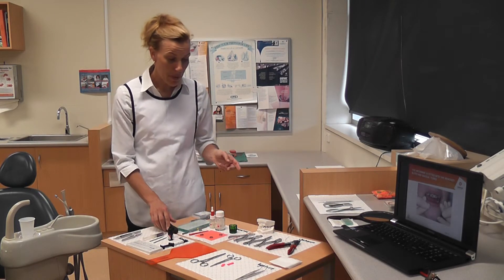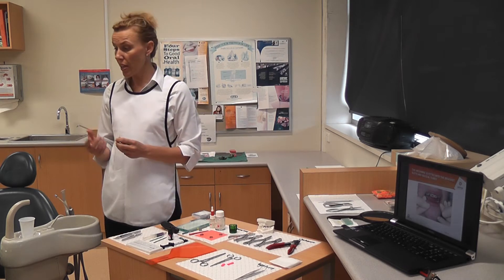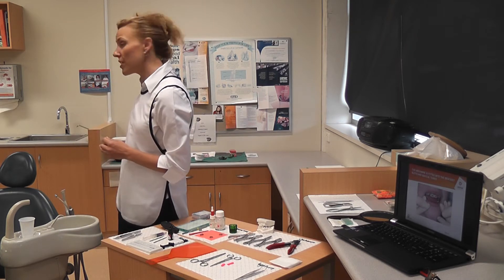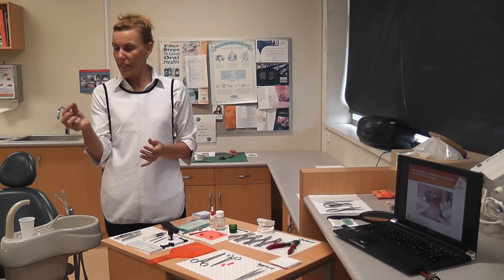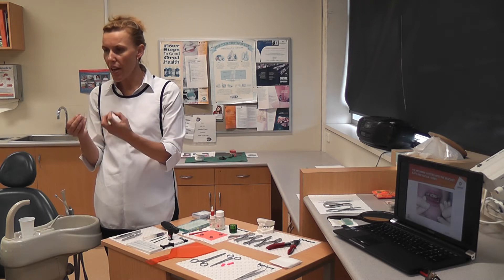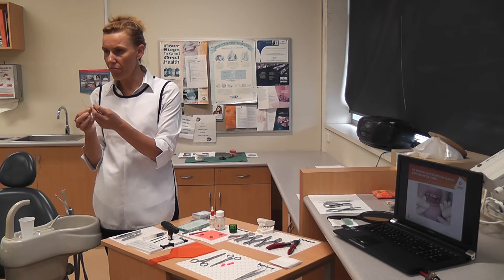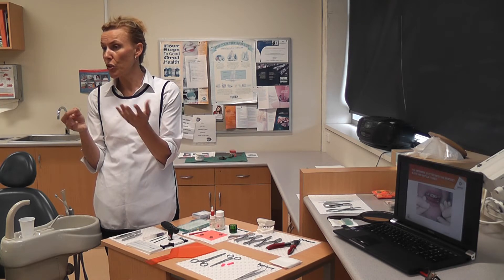The next step is to place the arch wire. Make sure you spend time looking at the example of what FullFix likes because it will give you an idea of what the components look like. This is an example of arch wire. These come in all different strengths and widths — skinny, big, and enormous — and the operator will know which one they want to use.